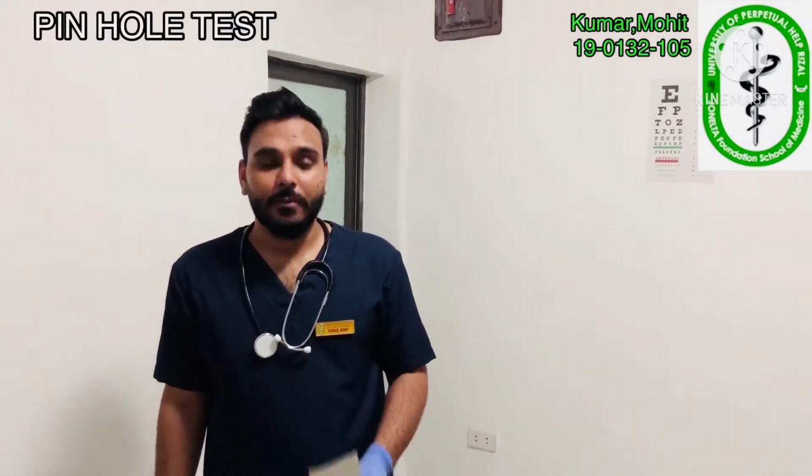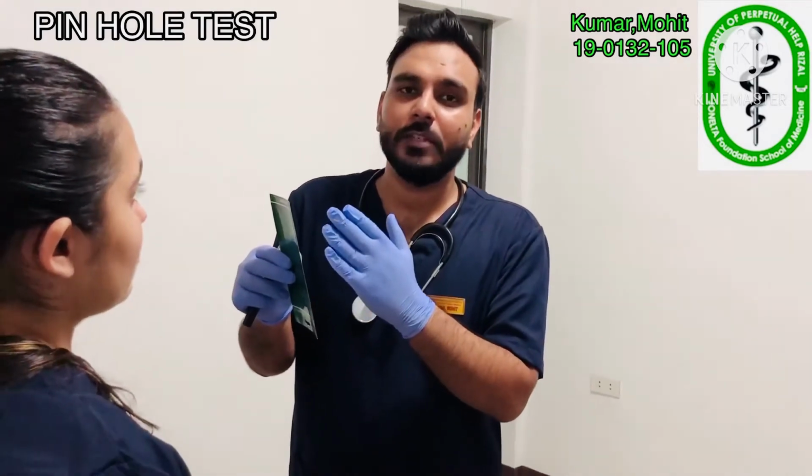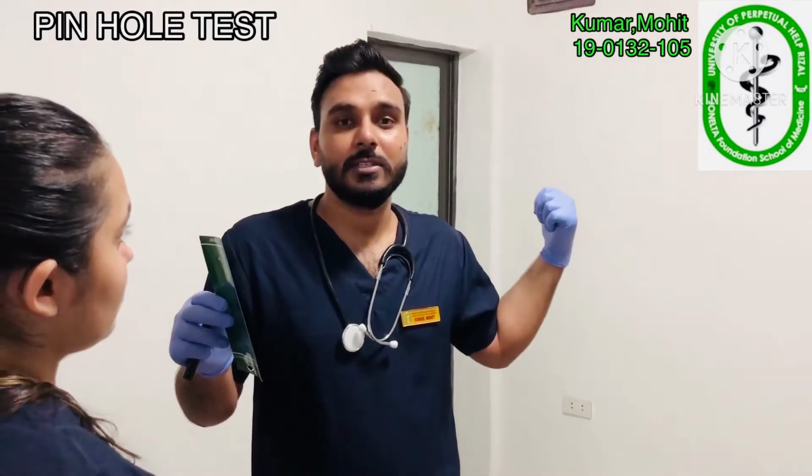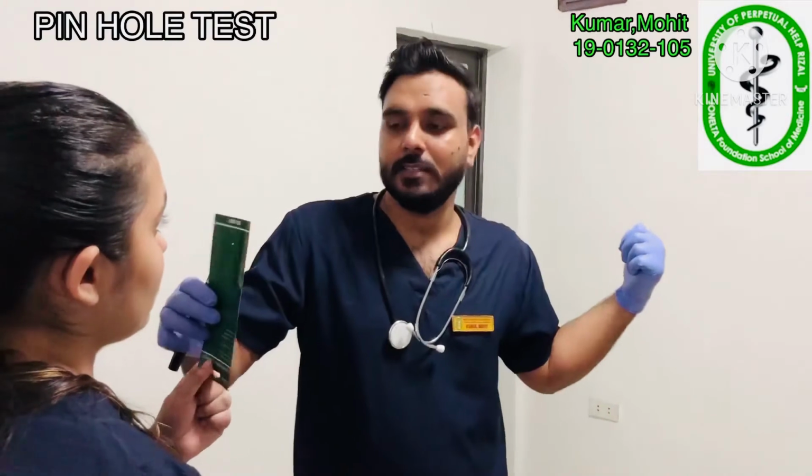The second test for visual acuity is the pinhole test. When we look through the pinhole, it will increase our vision. At least we can read one more line from this chart. So let's see, this is the pinhole test.